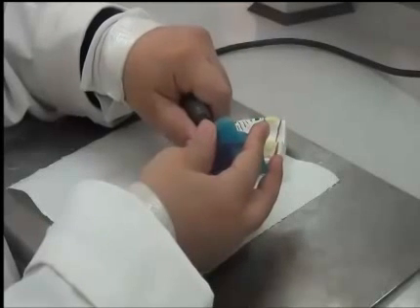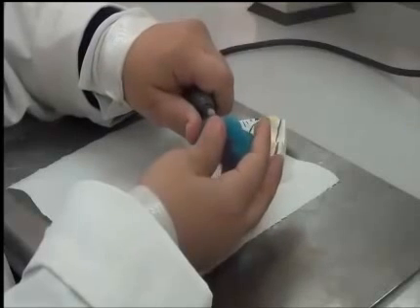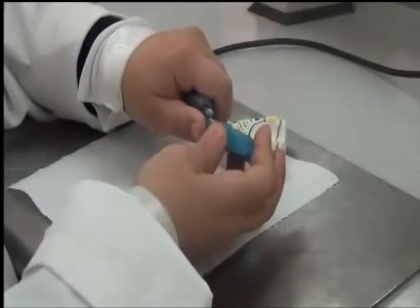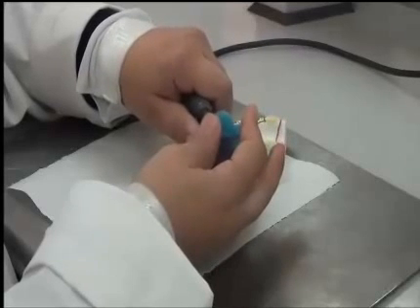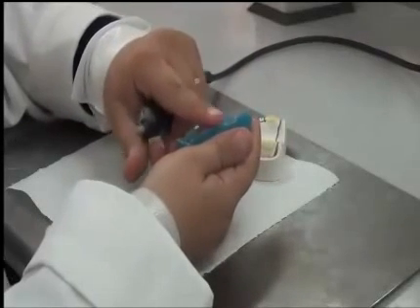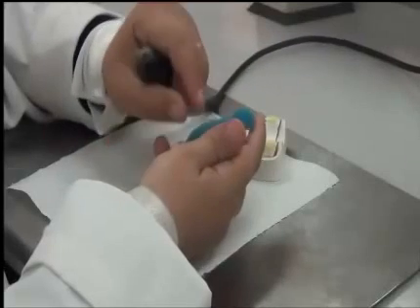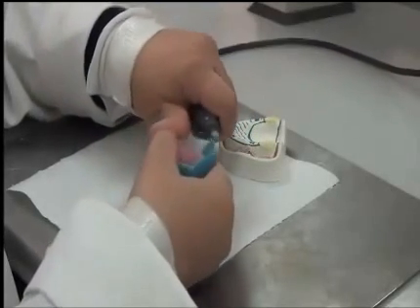In our case, if we place Vaseline on the surface, we don't need a lot of trimming on the surface, or any trimming. On the borders, if they are rough and kept rough, not sharp, but a bit rough, this would aid in the retention of the green stick later on. So I will leave these rough borders present, but they are not sharp. They don't injure the patient. They're only just rough enough to hold the green stick into place. Hand over the final border.